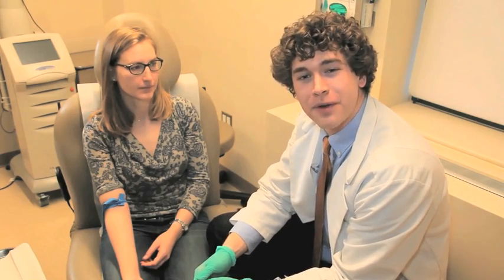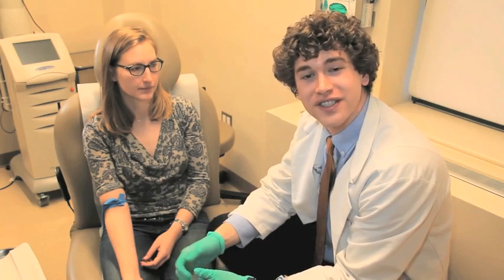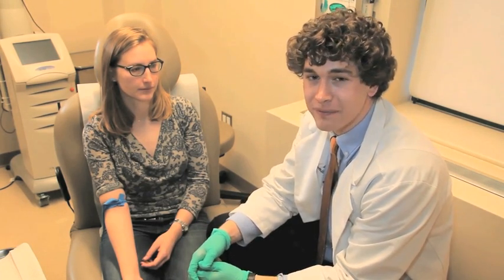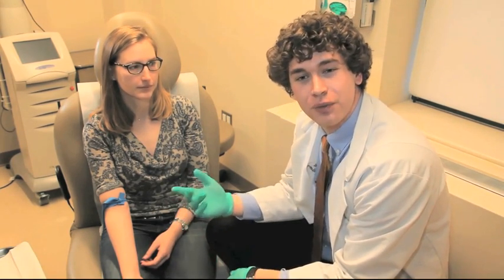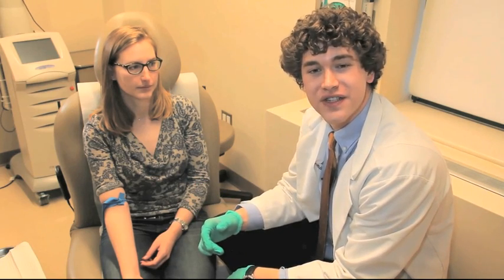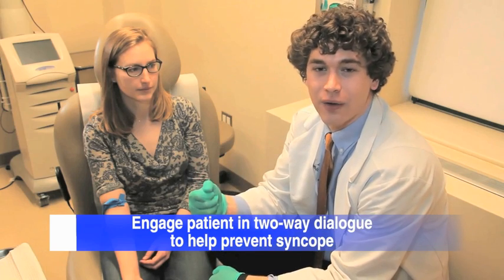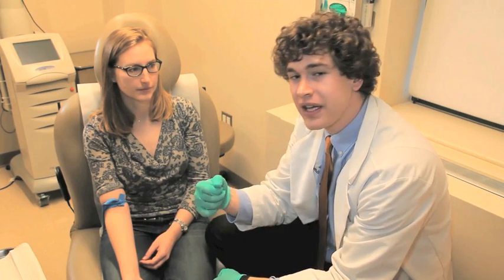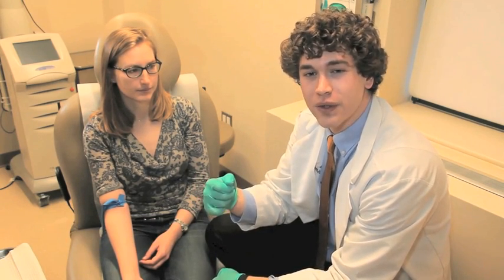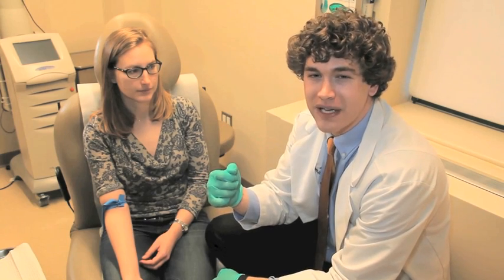At this point, patients susceptible to vasovagal reactions and syncope will begin feeling symptoms. Maintaining a conversation with the patient during the procedure is a useful method to monitor for signs of syncope. This conversation must be a two-way dialogue and not a one-way physician monologue. If the patient stops talking or answering briskly, then you know they might be about to faint.